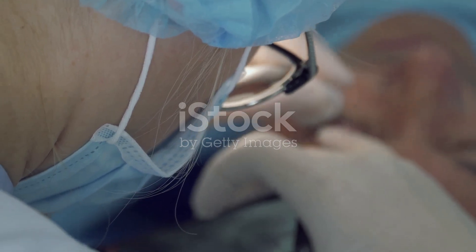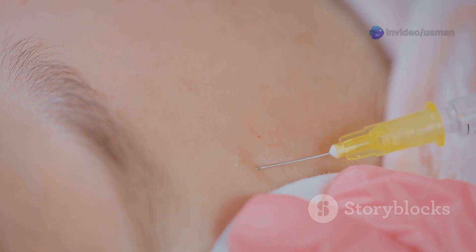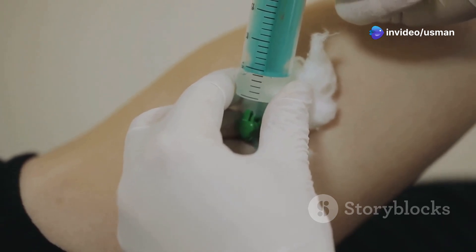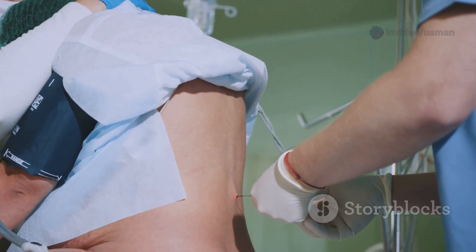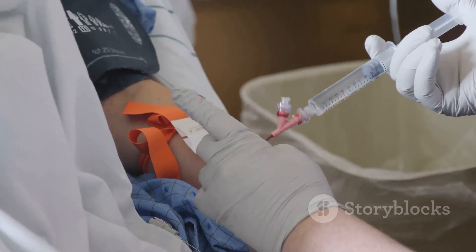Once the area is clean, hold the syringe like a dart and insert the needle into the muscle at a 90-degree angle. Slowly push the plunger down to inject the medication. After injecting, gently pull the needle straight out and discard it in the sharps container. Finally, apply a bandage to the injection site.